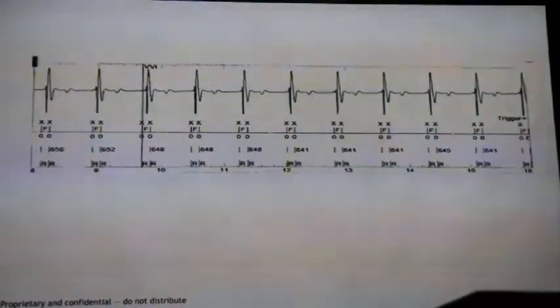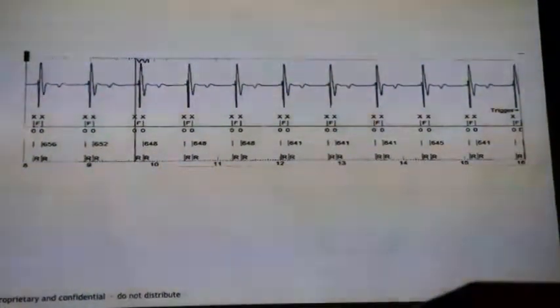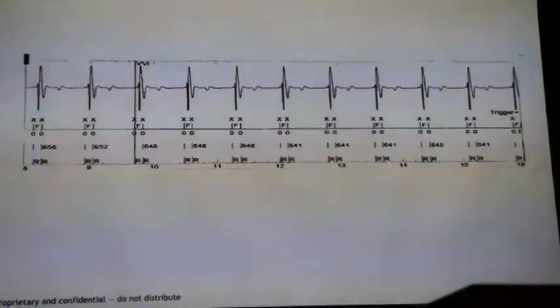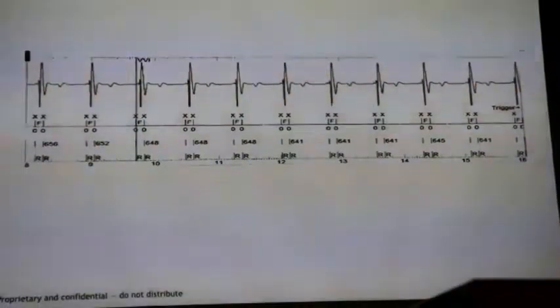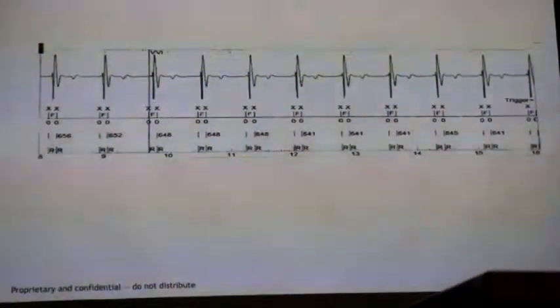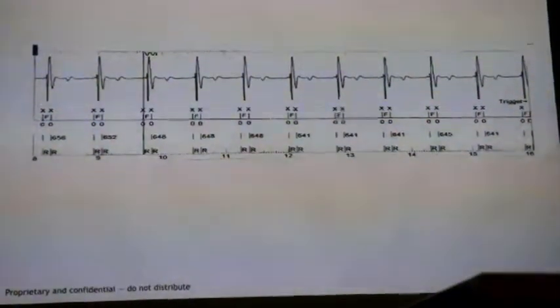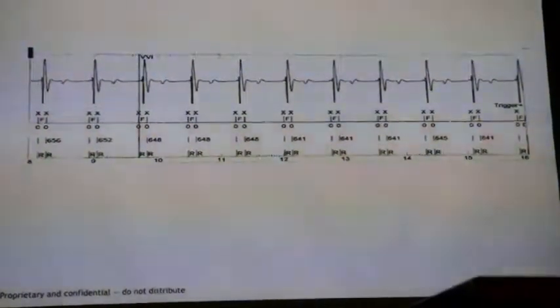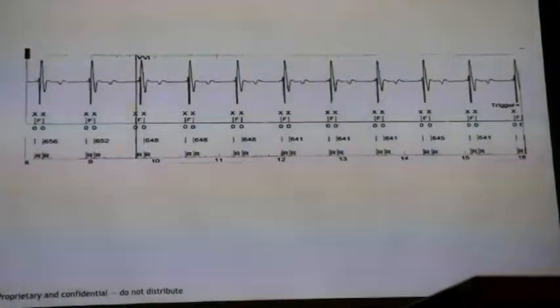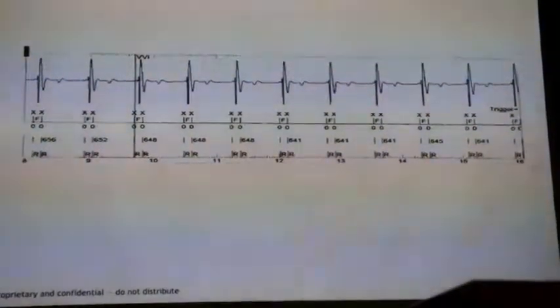And how much is the R wave measurement here? The R wave here was big actually. It was like a 12 millivolt R wave. Usually when you have a problem with sensitivity, it's a smaller wave, especially T-wave oversensing. T-wave oversensing pretty much is always tiny little R waves. You have to move your lead somewhere. That's why we're asking for signals greater than 5, 6 ish.